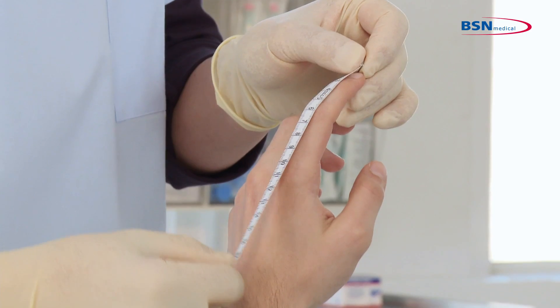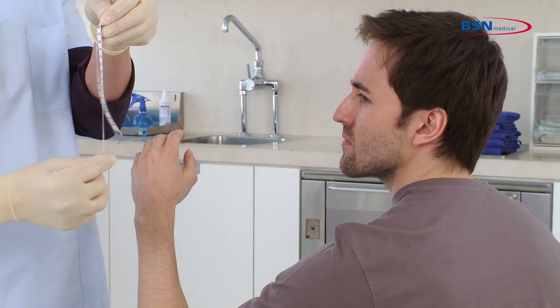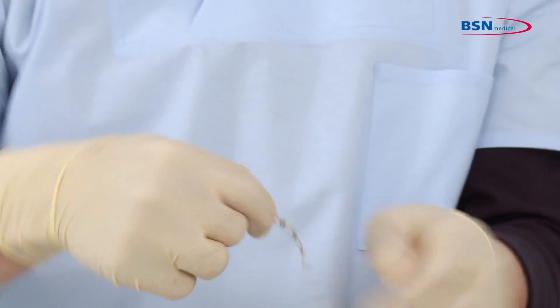To start, measure from the highest point of the tip of the injured finger to the wrist joint. The required splint size is double this length.